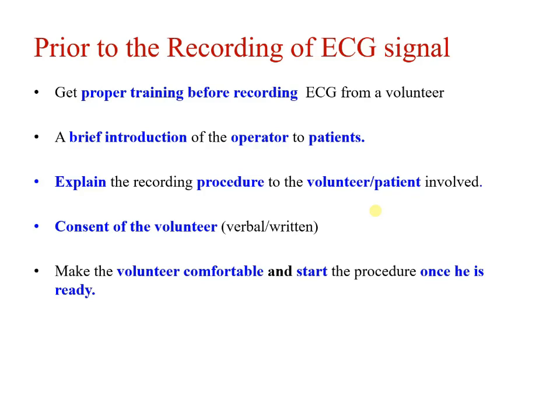So before taking the recording from the patient, you must get proper training and a proper idea of all the instruments and the procedure involved in this process.